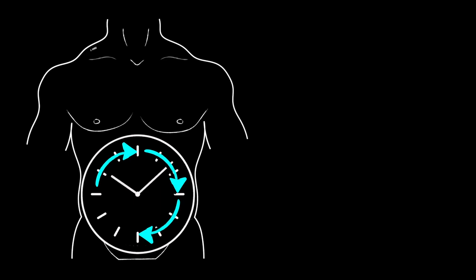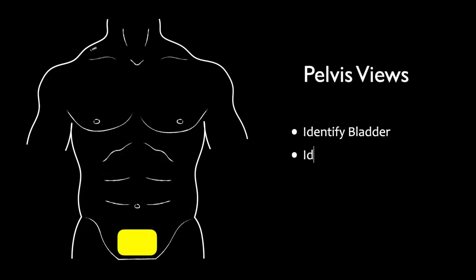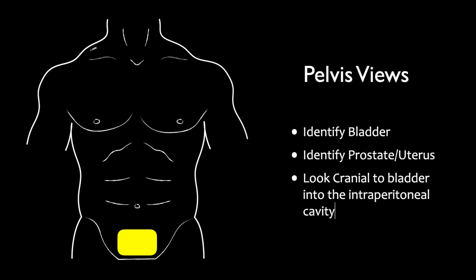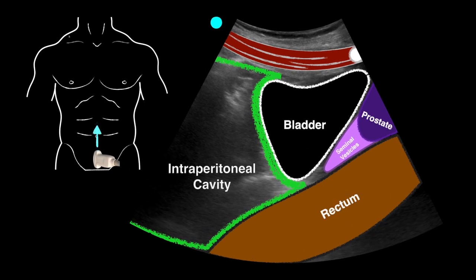After completing the left upper quadrant, we continue clockwise down to visualize the pelvis. We want to identify the bladder and any other organs — in males, the prostate; in females, the uterus — then look cranial to these structures into the intraperitoneal cavity. In a male patient, the probe marker is directed towards the umbilicus, dragged down right above the pubic bone. We see the bladder, and inferiorly the prostate and seminal vesicles. Those are not part of the intraperitoneal cavity, so we look up into the abdomen for free fluid.